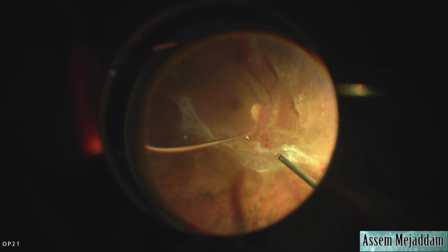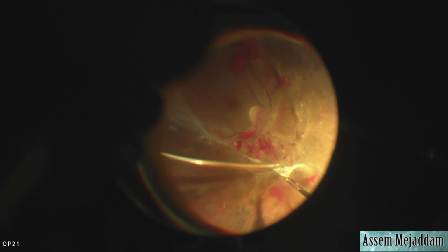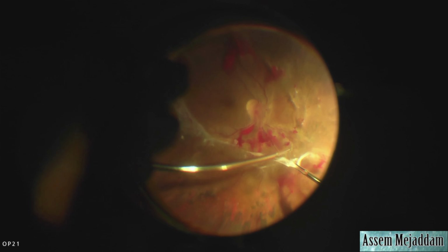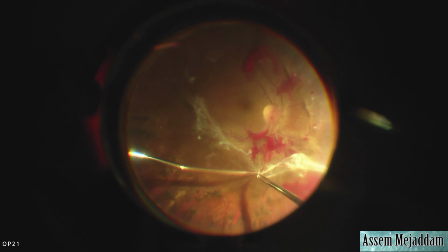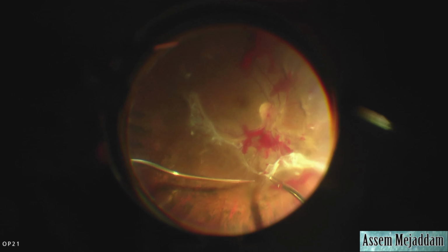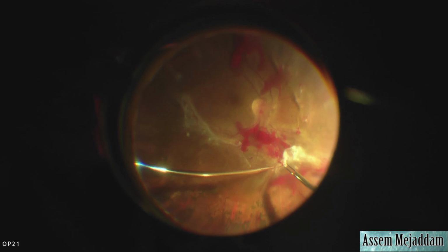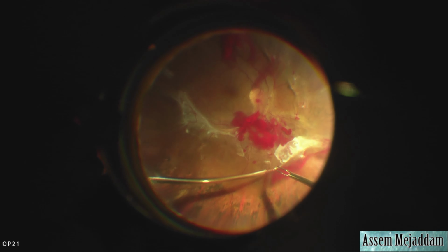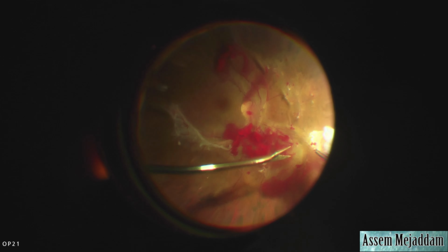And so here I've pushed it slightly too far in this very ischemic retina. There's a very small hole there, so I convert to bimanual technique using forceps and scissors. And so I'm slowly dissecting and delaminating those fibrovascular membranes, which are extremely adherent to the very ischemic retina. And there are multiple pegs between those fibrovascular membranes and the retina, which need to be cut off.